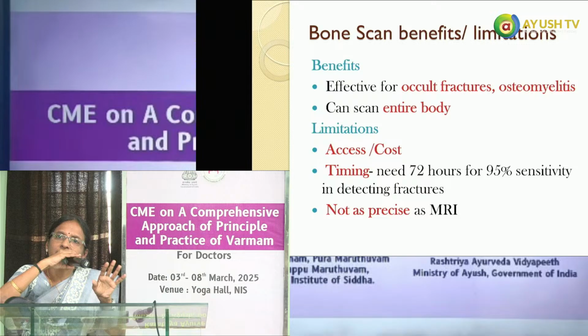So bone scan ஓட advantages, overall bone scan has not that much of a role in orthopedic trauma. Just for the part of discussion, என்னெல்லாம் அதுல தெரியும் அப்படின்னு தெரிஞ்சுக்கிறதுக்காக we discuss about bone scans. But for our kind of setting, orthopedic trauma, we will not directly go in for a bone scan. So அப்படியே எடுக்கிறதா இருந்ததுன்னா ஒரு MRI scan அளவுக்கு அந்த occult fractures, osteomyelitis, bone scan leave நல்லா தெரியும். And இன்னொரு advantage, full body can be scanned at one time. ஒரு பார்ட்டா பண்ணாம the full body will be scanned.